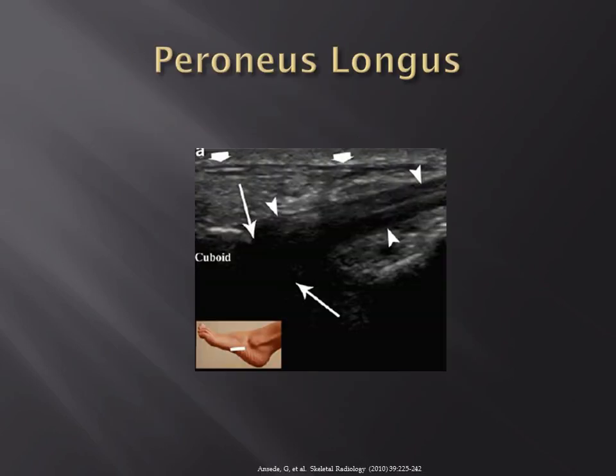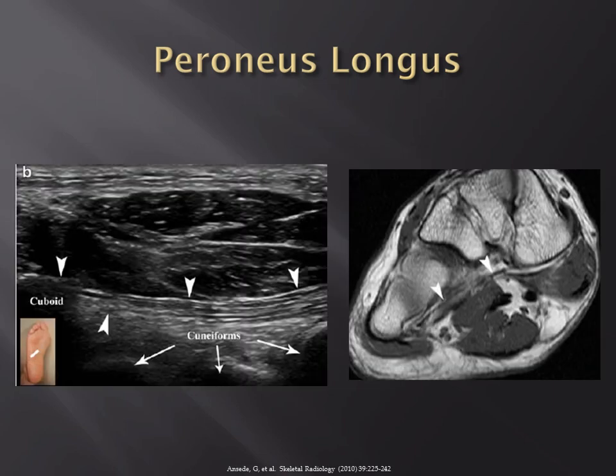Some of the tendons of the midfoot now. Well, we've heard about these through their extent from the ankle distally, so this may be a little bit redundant, but the Peroneus Longus tendon, as it extends to the level of the cuboid, you can see, and as it courses through the groove along the plantar aspect of the foot, the Peroneus Longus can be demonstrated through its course attaching to the base of the first metatarsal.